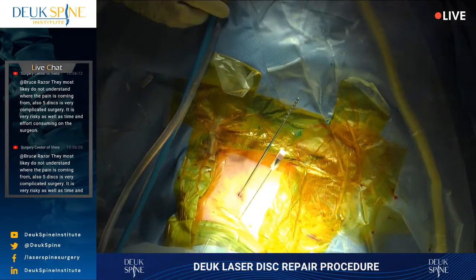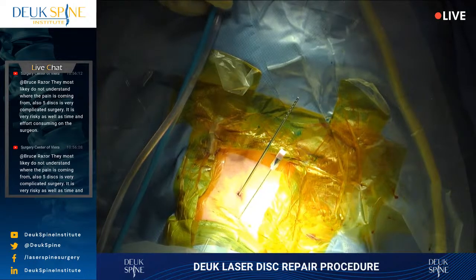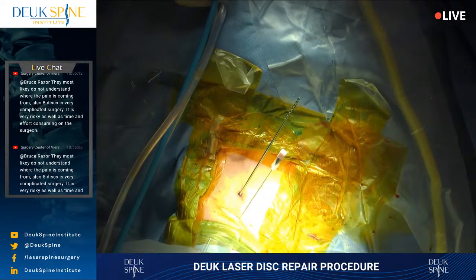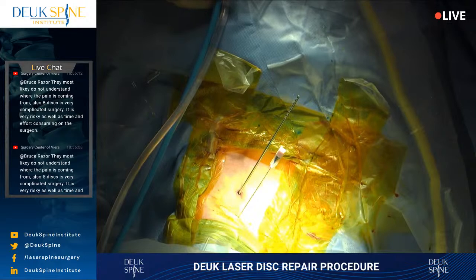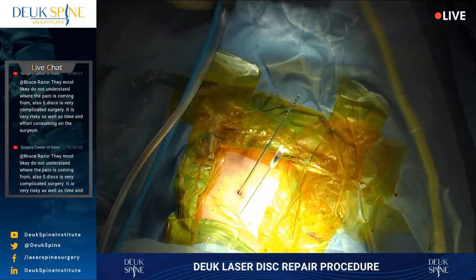I want to make sure we're lined up with the end plates. And I think you're off on the orbit a little bit. Shot. You can relax your hold on the head. All right, so try to make that better. It's pretty collapsed space. We are going to have to get to the back of the disc though to fix it.